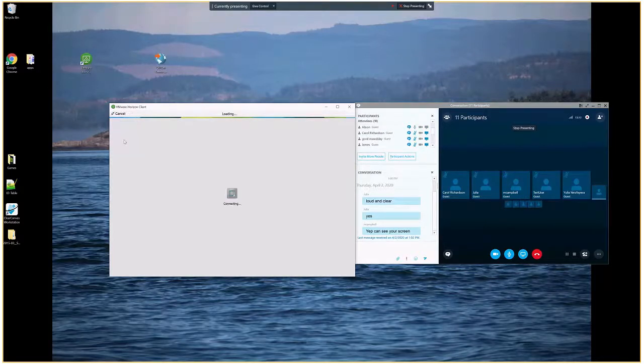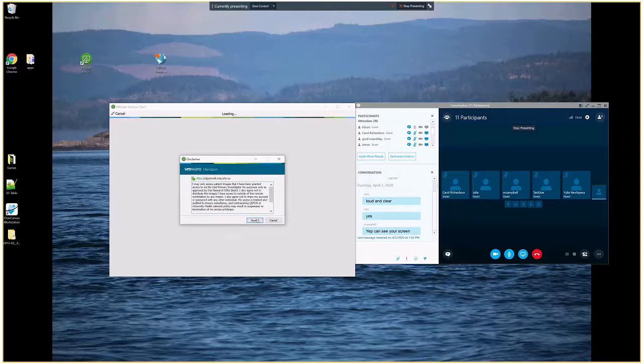They type in the server, which we provide to them, as well as a manual when they first start up. They have to acknowledge that they're only using images that they're allowed to see. Well, sorry, I should go back. It's not that, because they will only have access to images they are allowed to see. It's mostly saying we're not going to take these images and email them to someone, or go to a Google Drive and try to store them there. Those are ways to get around trying to save the images on the infrastructure, because otherwise all images are locked in here. They can't save them to a local drive or anything like that.